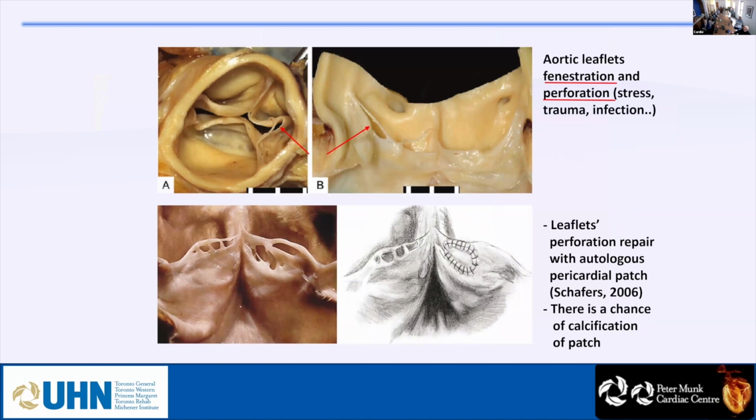And there's a question of whether a leaflet fenestration is a contraindication for repair. If it's a small fenestration, no, because a small fenestration is very common, but if it's a large fenestration, it might be a contraindication.